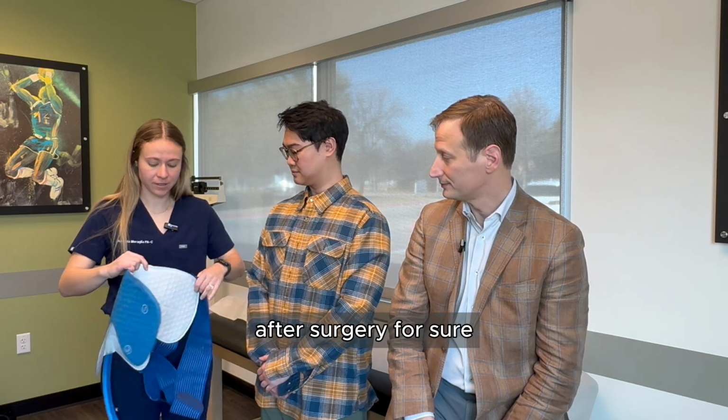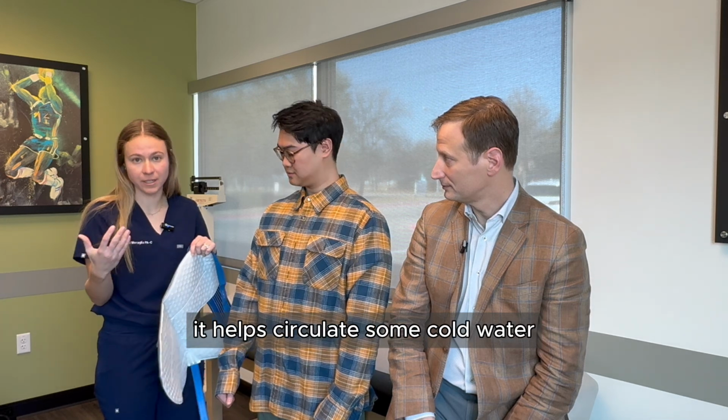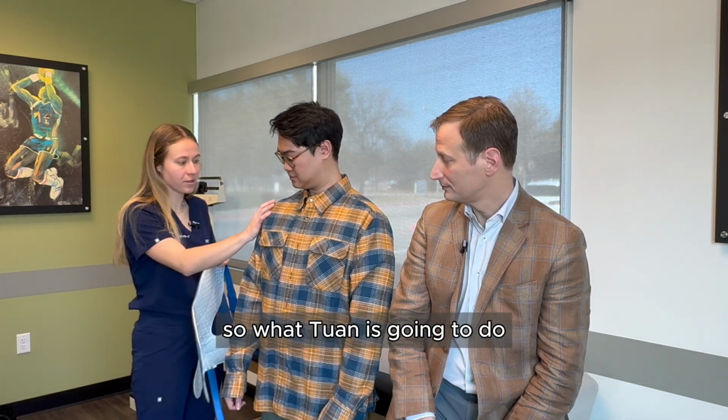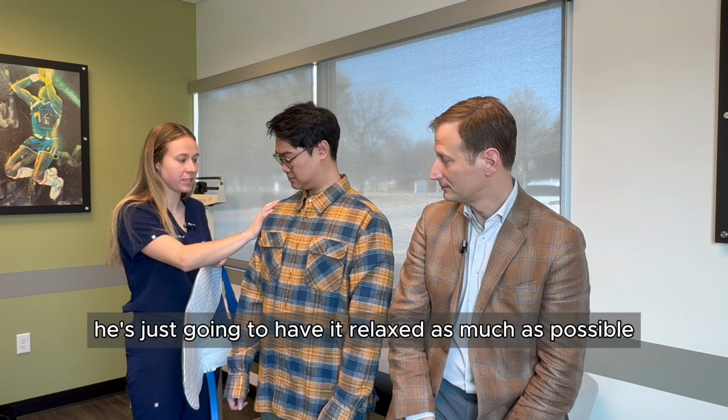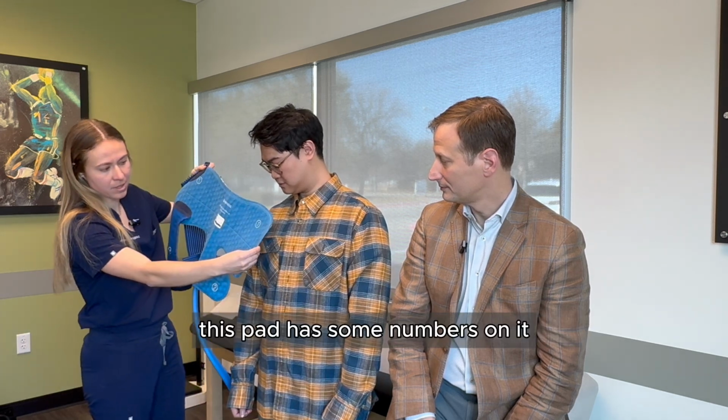For sure. So this is an ice pad that's going to go on afterwards. It helps circulate some cold water. So what Tuan is going to do, we did surgery on his right shoulder. He's just going to have it relaxed as much as possible. This pad has some numbers on it.